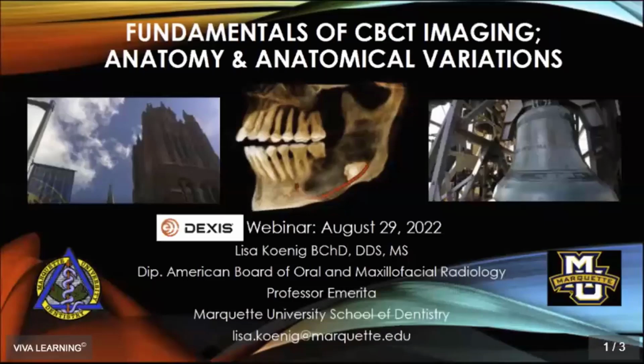Does axial view mean looking up from the floor, up or head down? Oh, yes, I apologize. I usually say that when we talk about the axial views. So axial views, yes, is just like in dental imaging. When you look at an axial view, the patient's right side is your left side.